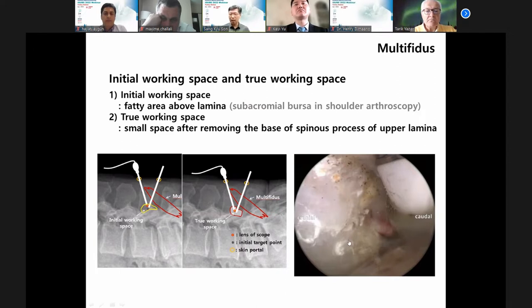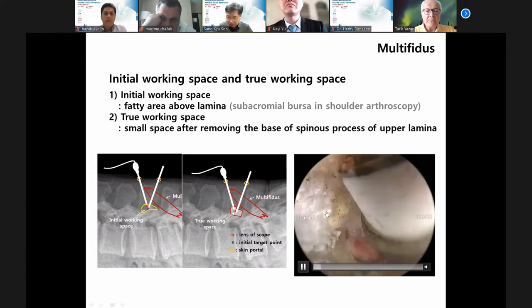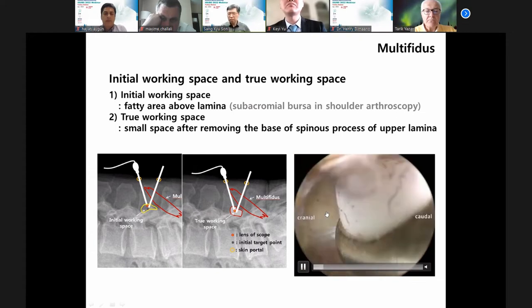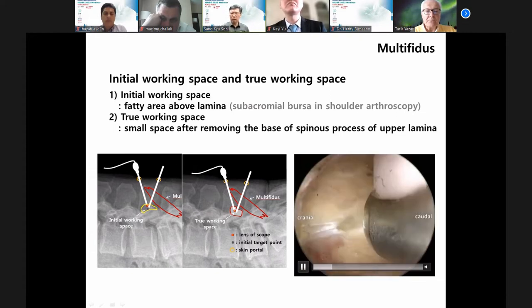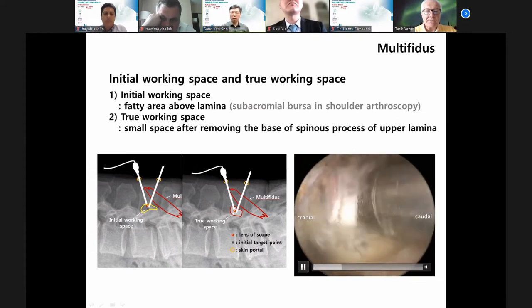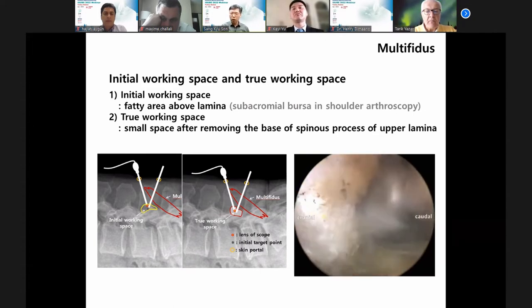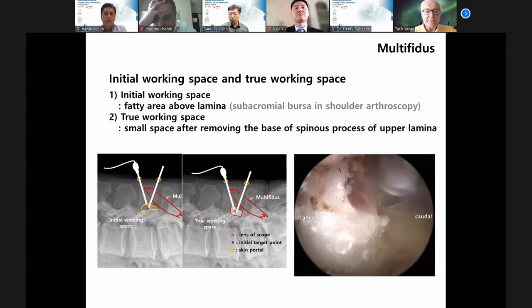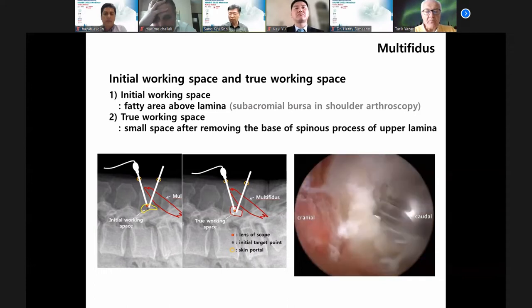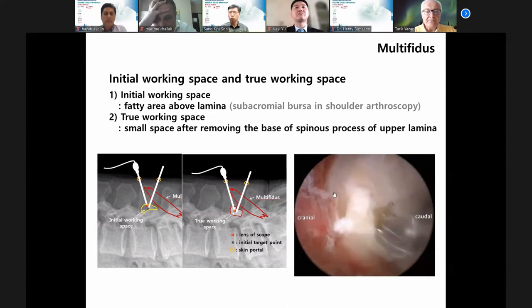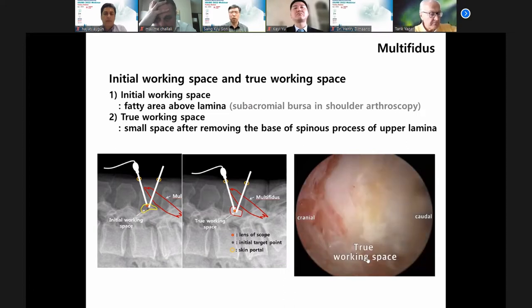This is the midline, the base of the spinous process. After drilling out a small portion of the bone lamina, you can make true working space without soft tissue interference.